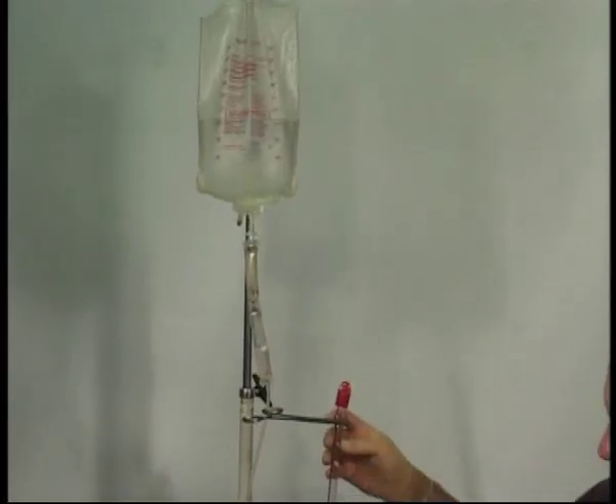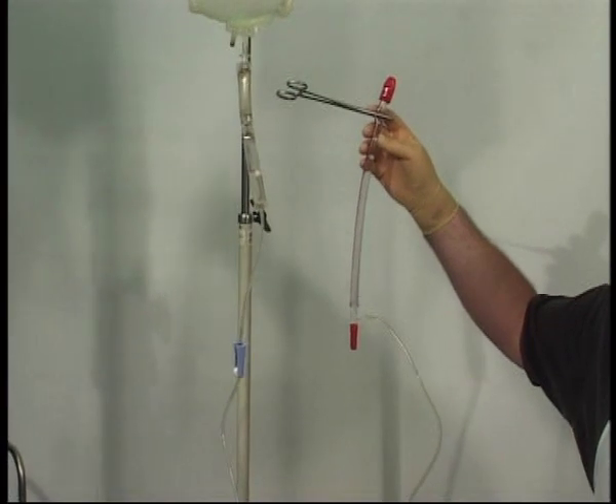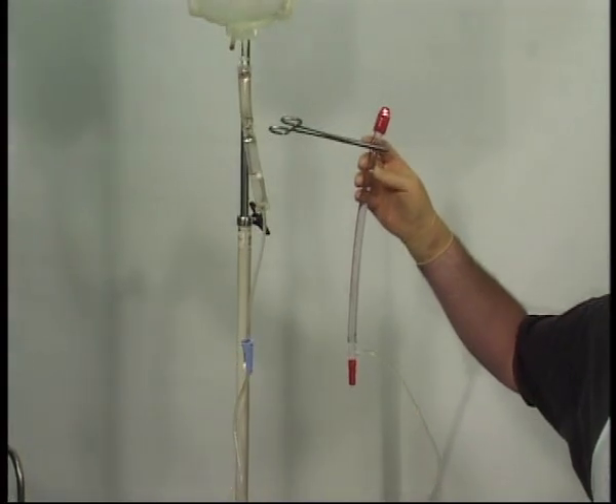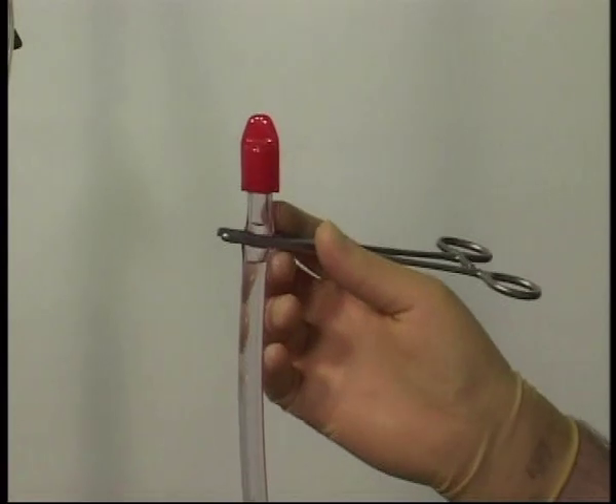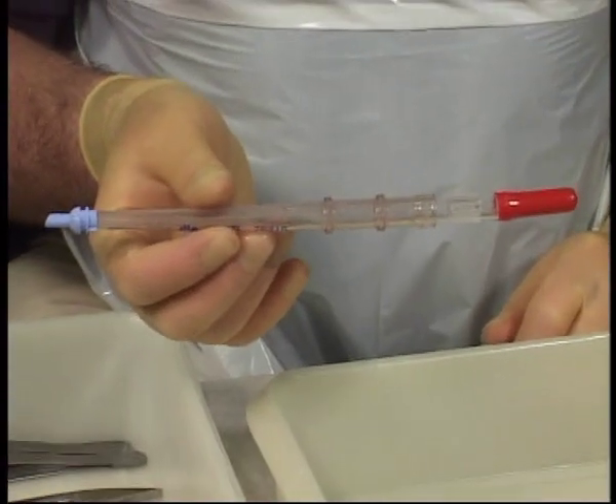You can create a simulated bypass circuit using a bag of saline or water connected to bypass tubing and clamped. A standard aortic cannula is required.